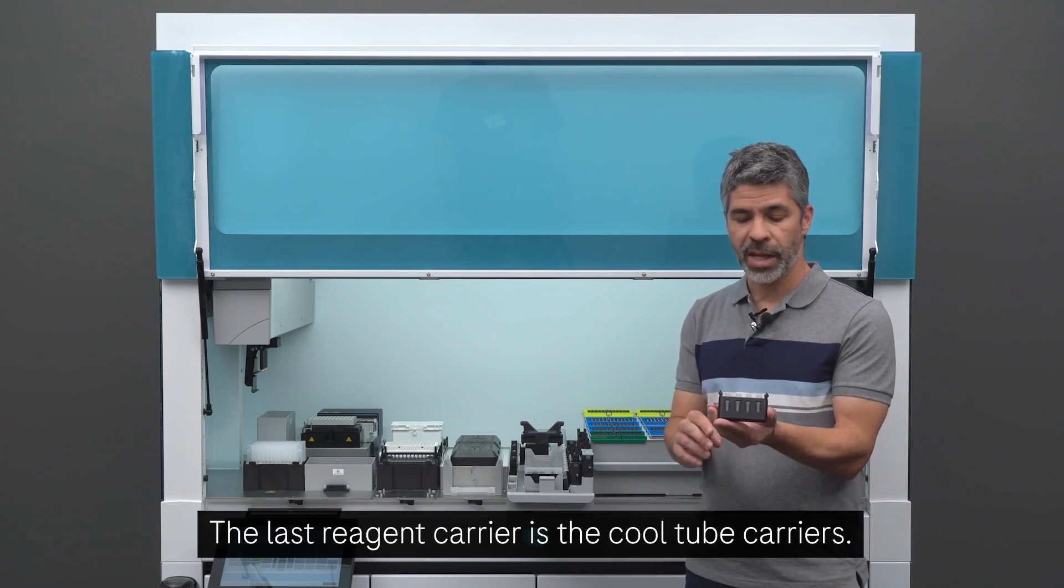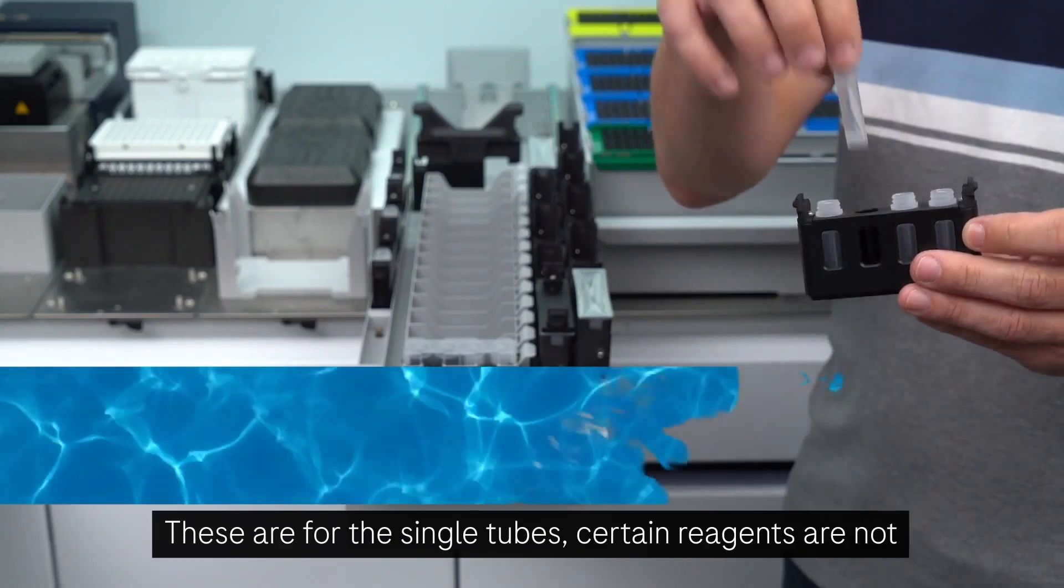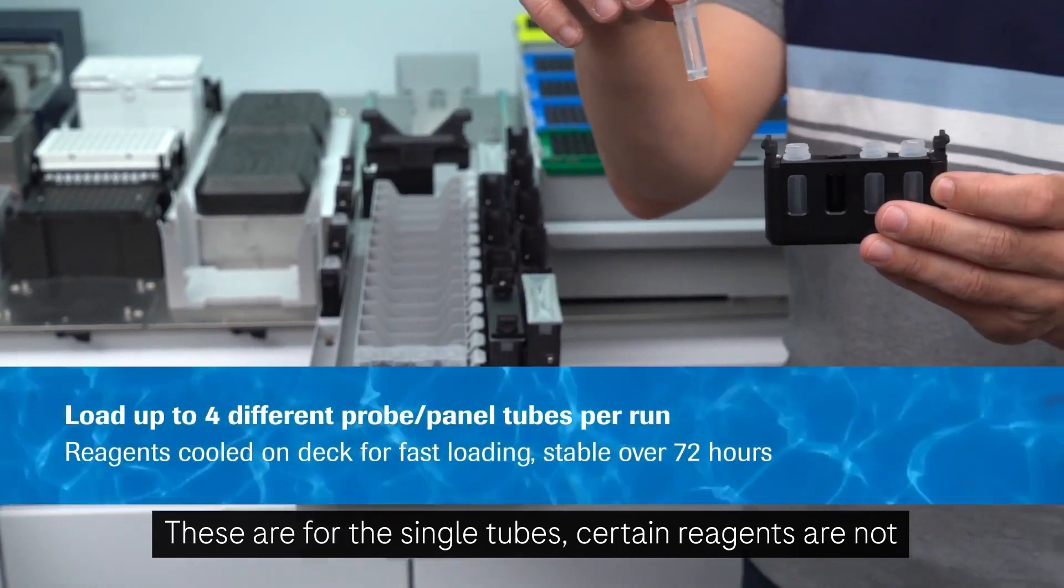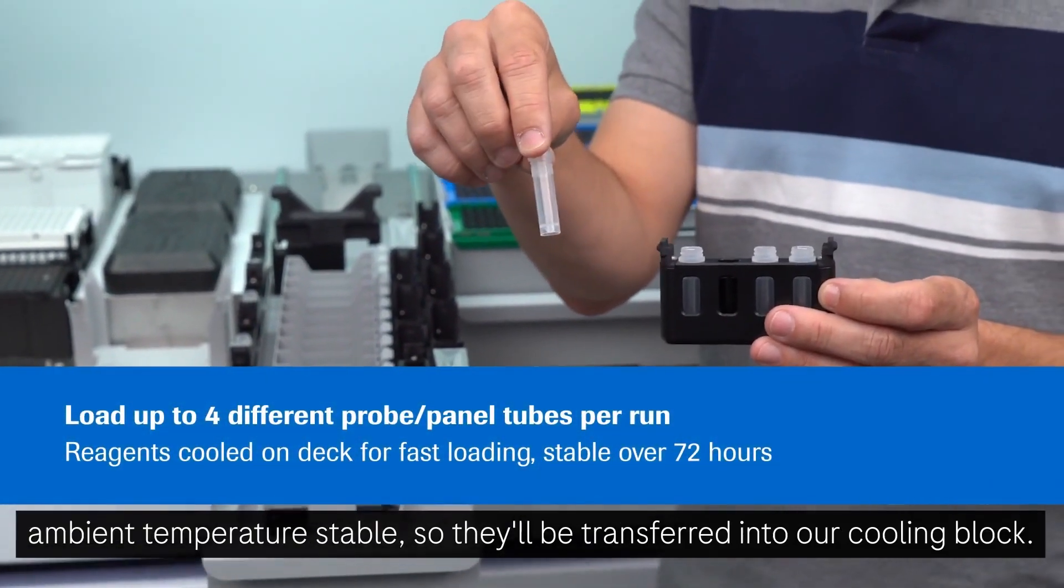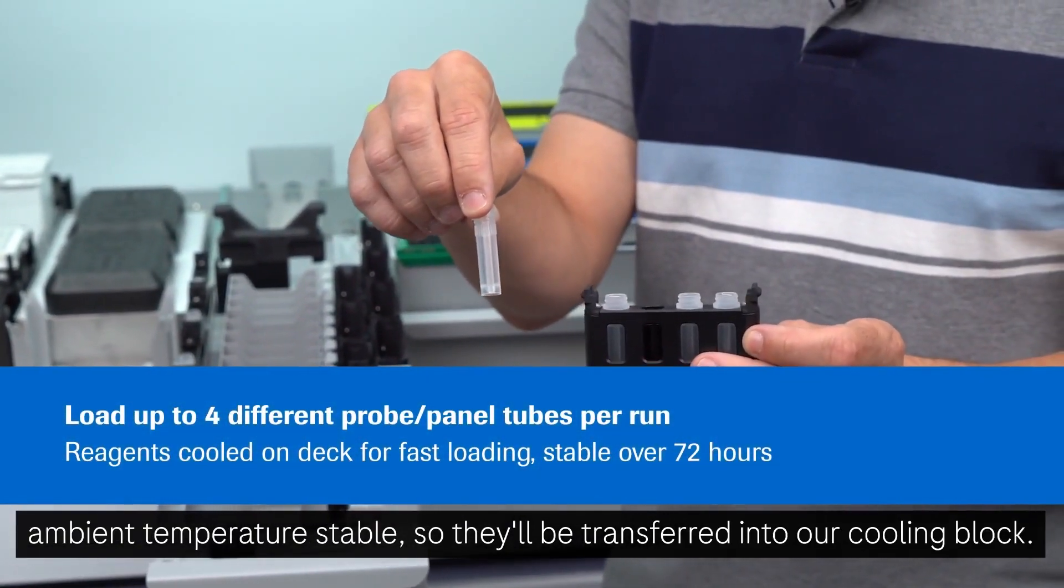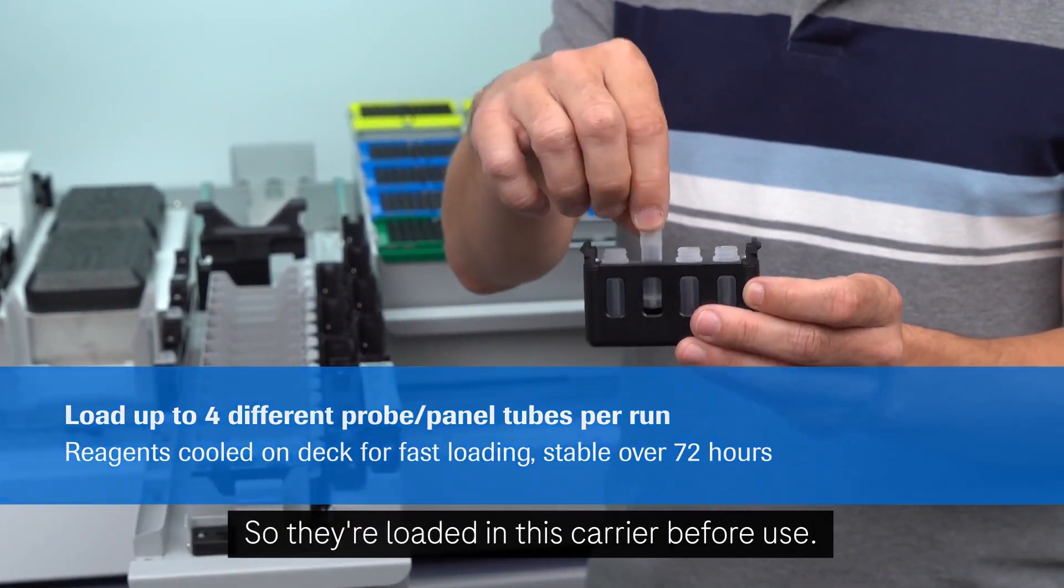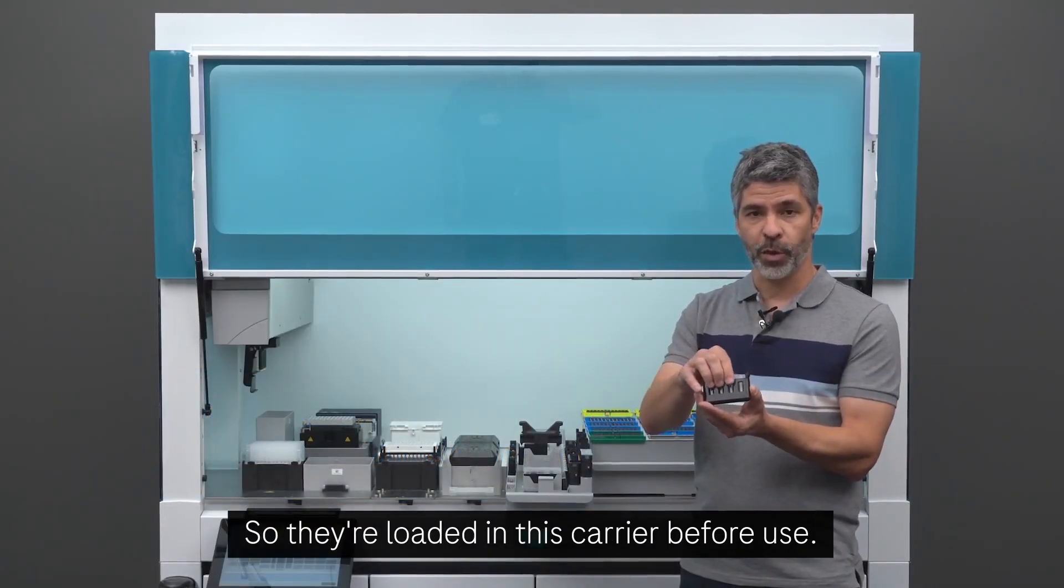The last reagent carrier is the cool tube carriers. These are for the single tubes. Certain reagents are not ambient temperature stable, so they'll be transferred into our cooling block. So they're loaded in this carrier before use.